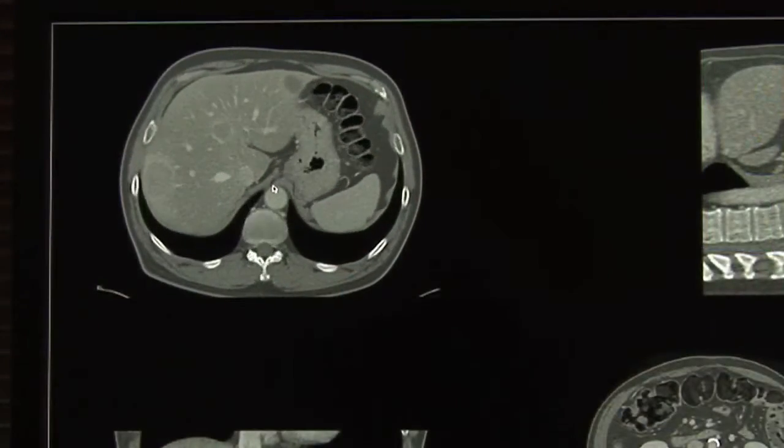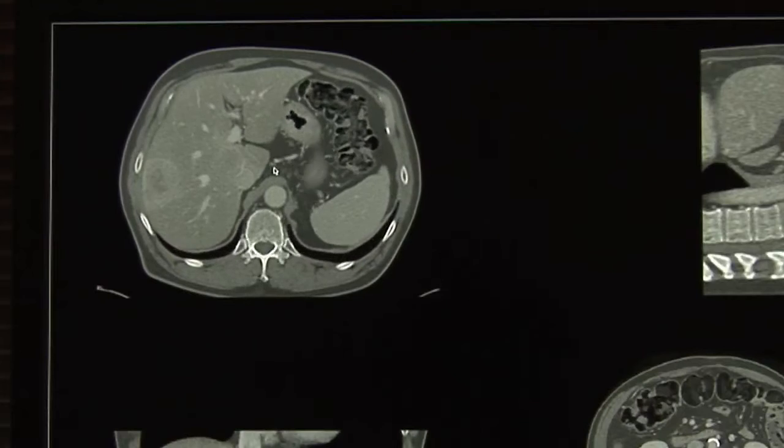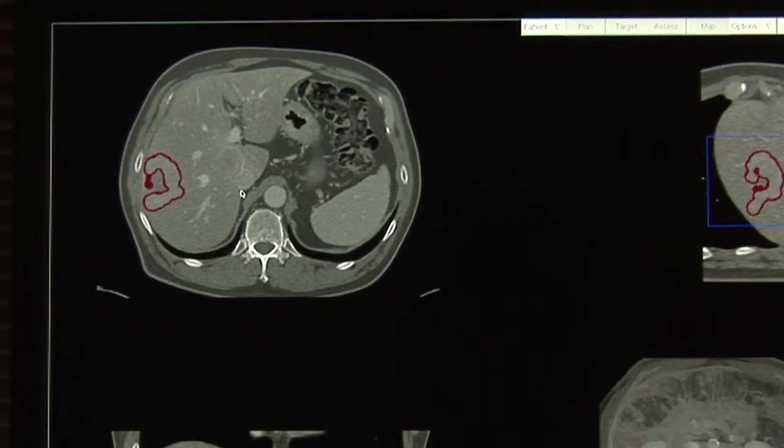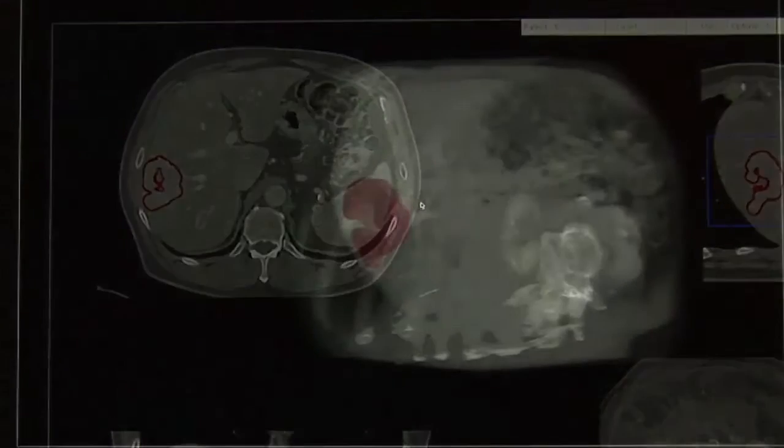In case of a complex shape, it would be essentially impossible. Most tumors have tentacles, they're bilobar, they have many differing shapes, and that's where we run into problems with measurements. You may find the long axis of one tumor, which if you go up or down a slice, the long axis changes. So complex shapes make it very difficult for us to calculate longitudinal measurements. For example, what appears to be a simple spherical neuroendocrine tumor is in reality a complex shape, the volume of which cannot be established from any linear measurement.